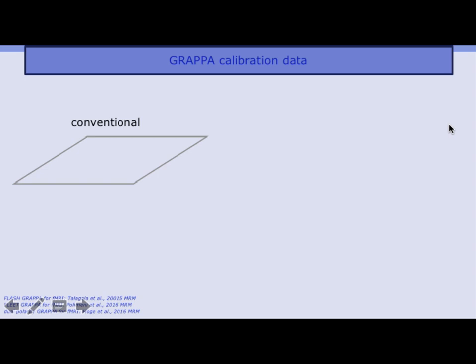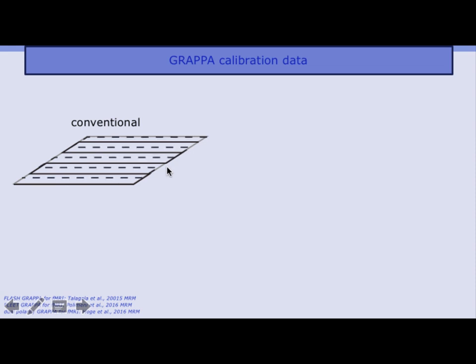Even more important than the phase errors in the actual EPI acquisition are the phase errors during the calibration scans for the acceleration. And I'm sure for any kind of high-resolution, high-field fMRI, you do some kind of in-plane acceleration with these methods called GRAPPA or SENSE. And for very unfortunate reasons, the conventional approach to acquire these reference scans is that you first acquire every other line, and then one TR later, you acquire the missing lines. And the unfortunate fact comes in because there might be a lot of phase errors between the different segment acquisitions.